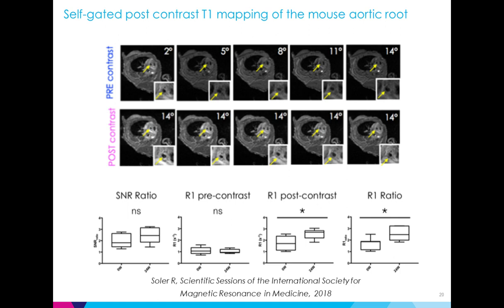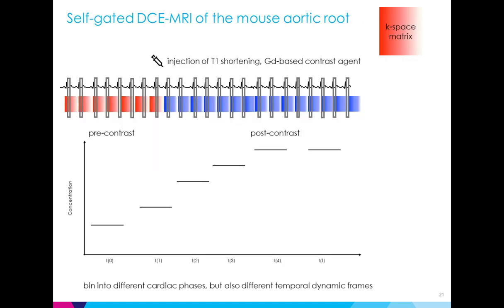If you recall, during the introduction, I said that this is not the only way to calculate endothelial permeability. We can also use what we call dynamic contrast enhanced MRI to try and follow more closely, with higher time resolution, the contrast agent uptake curve in the tissue of interest. In this case, our acquisition is basically the same, but we reconstruct it a little differently.